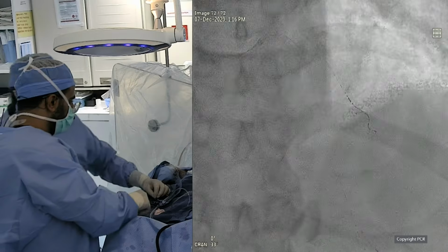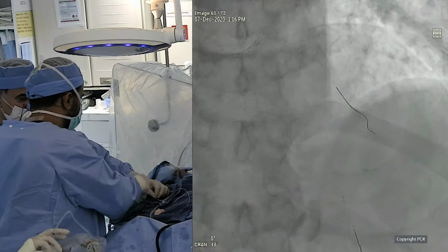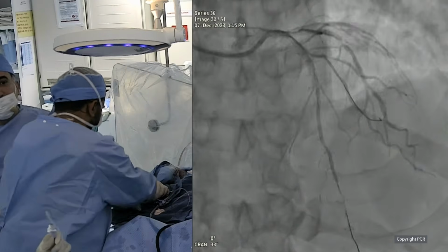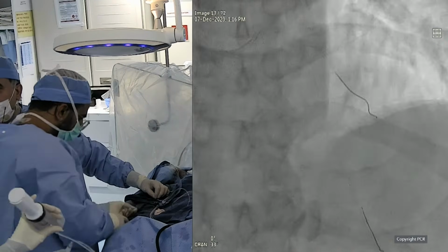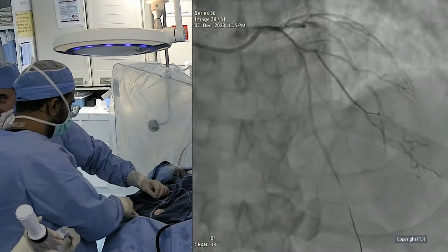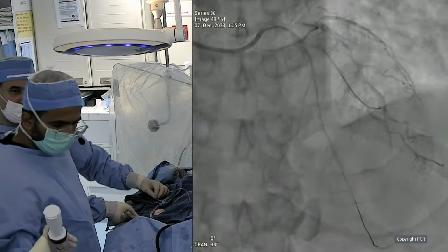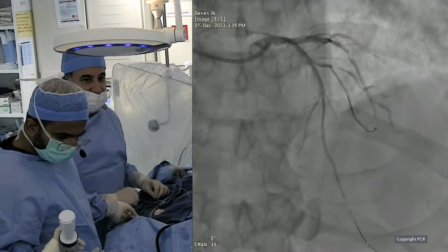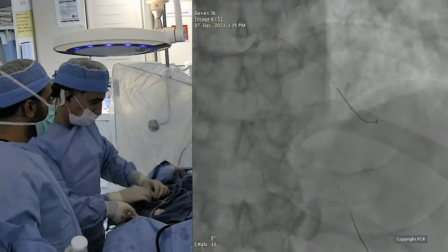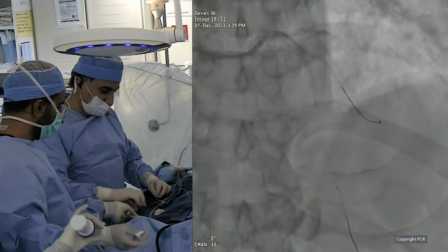It should then be nicer to go back and take a 3.5. Measure also the length from OCT, because that is crucial. It seems to be a very long segment. Distal 30? That's after the diagonal, where I will land. So by OCT, it's 275 by 30. 275 by 30, yes? I'm sure.